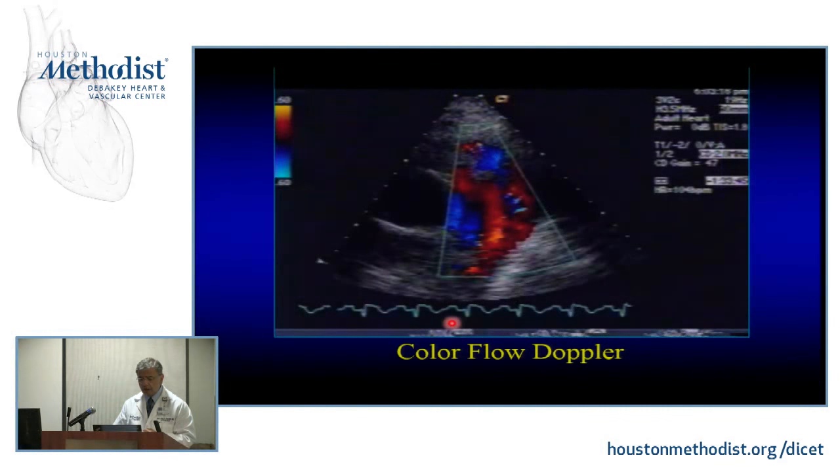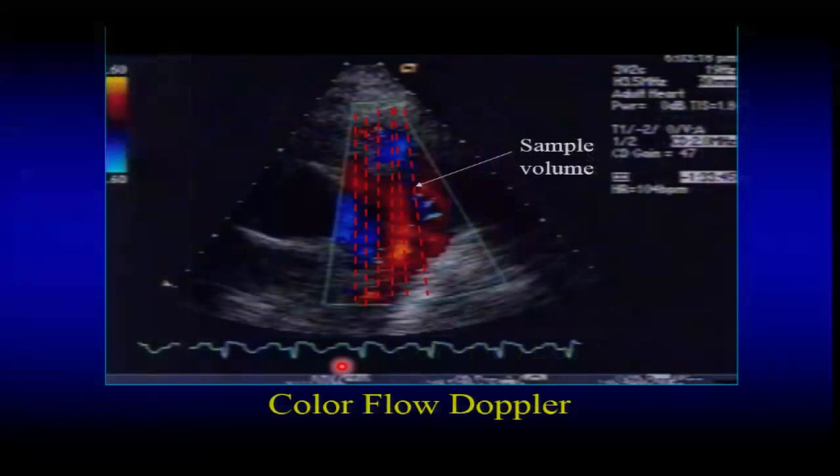Okay? So how about color Doppler? Color Doppler is not much different in a way. Color Doppler is an estimate of pulse Doppler technology. It is really an estimate of that, and it is made of little tiny sample volumes. You're not going to have the time to solve this well, so it's an estimator. You don't use a fast Fourier transform analysis to come up with the velocity, so we give you an estimate. And the estimate is, what's the mean velocity on the average in that area? Which direction? Is it going forward or is it going backward?